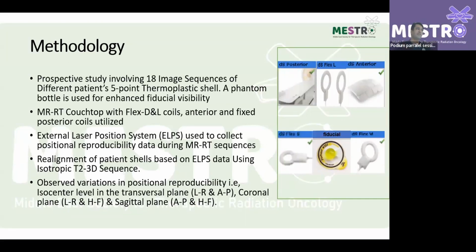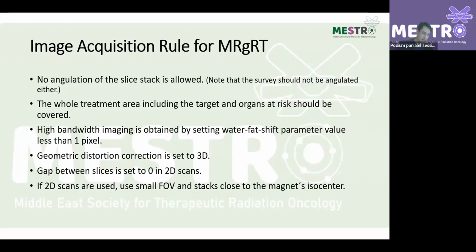Let's suppose one person on one day did one position on the machine lasers, then he shifted, and we see how much it shifted, and how efficiently another person can reproduce the same setup. Then he noted this variation from the outer laser till the center in his study.